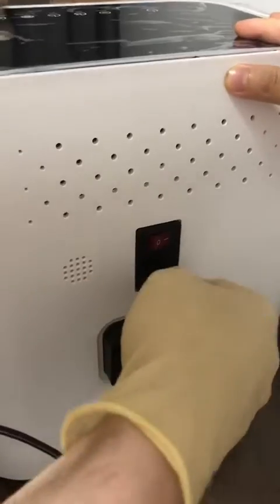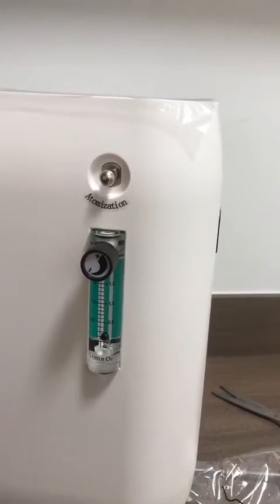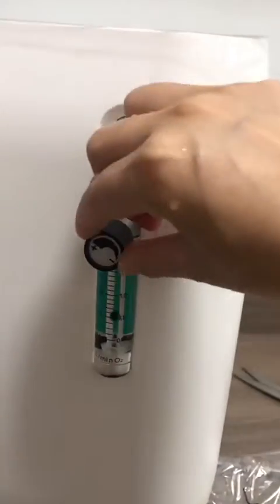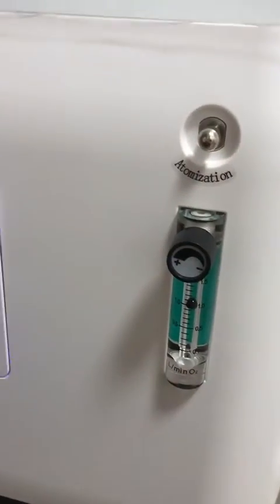Now let's try and hold it on. Okay, so. Let's try so. Okay, and now let's do this stuff. Now we don't use this thing.